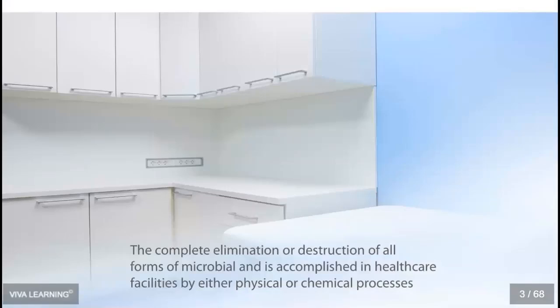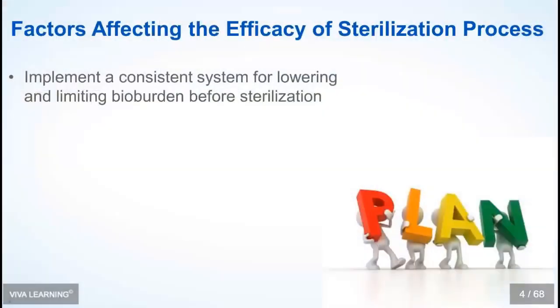Just a quick definition: sterilization, the goal is to eliminate or destroy all forms of microbial life to render the instruments safe for use with patients. There are a number of factors that affect the sterilization process, and we've all heard the stories from Oklahoma, most recently Florida, where inadequate sterilization has led to the possibility or the risk of transmission. And we know that the case in Oklahoma was the first documented case of direct transmission of Hep C from one patient to another. So these are just some of the factors that might affect it.